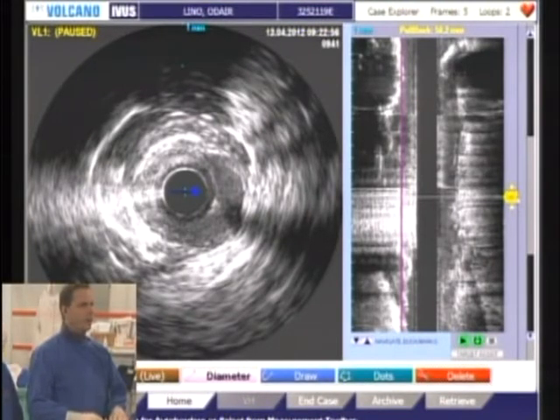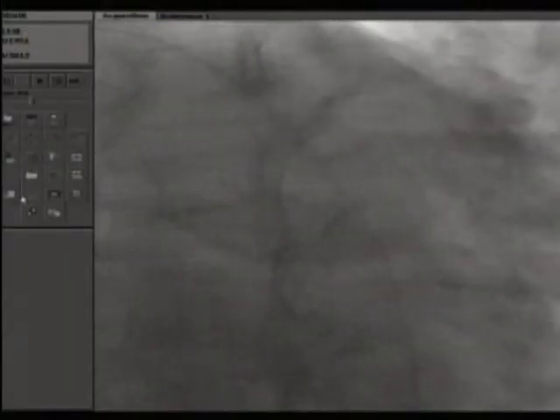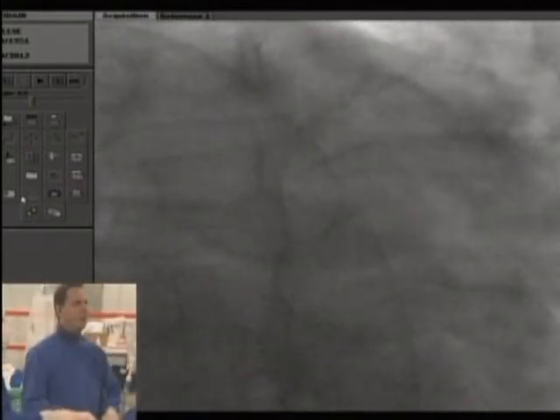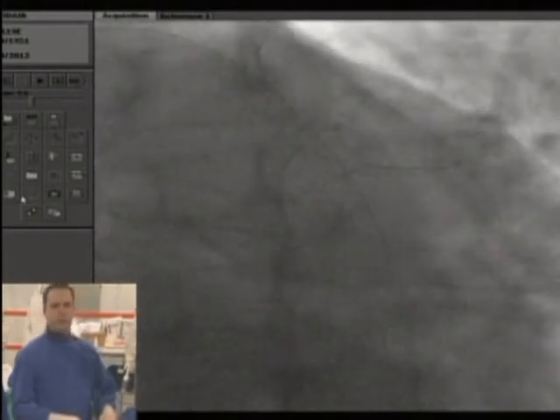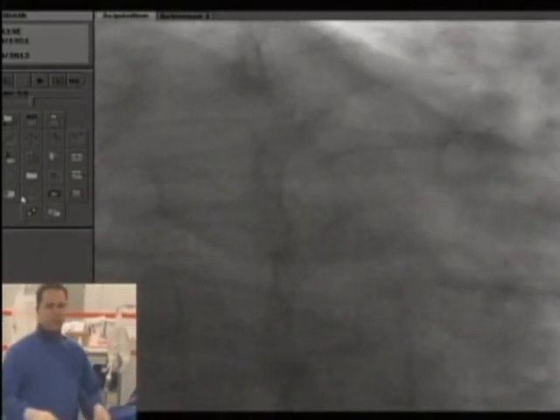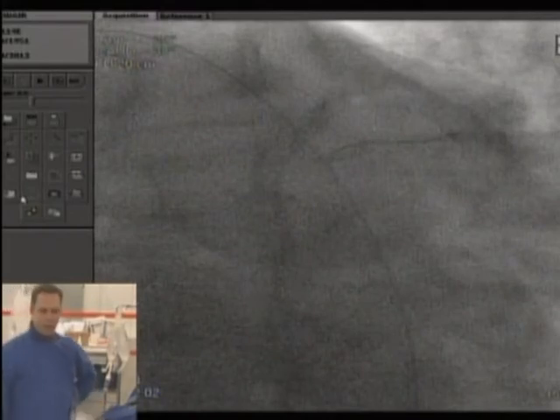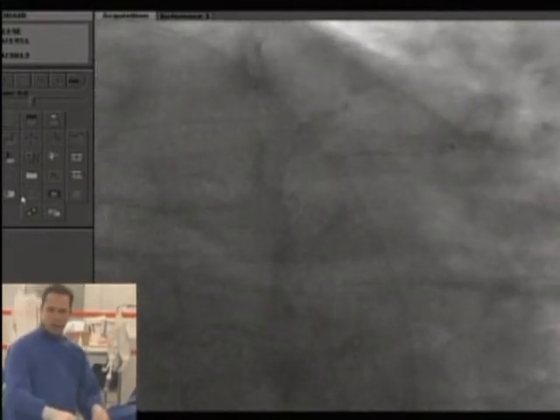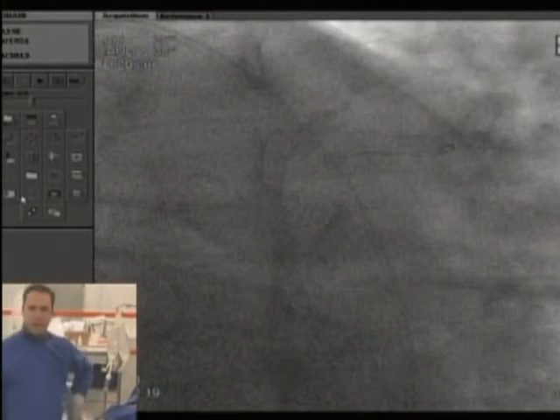I think that it's underexpanded, and you see here that you still have the IVUS. You have the stent struts, and you have calcified plaque behind the struts. So it used to be calcified also at that time. Most probably that was the problem at the time too, to dilate this calcified lesion. So we decided to treat the whole segment in the stent and outside of the stent too. Therefore, Eberhard, we did not use the drug-eluting balloon in this case.